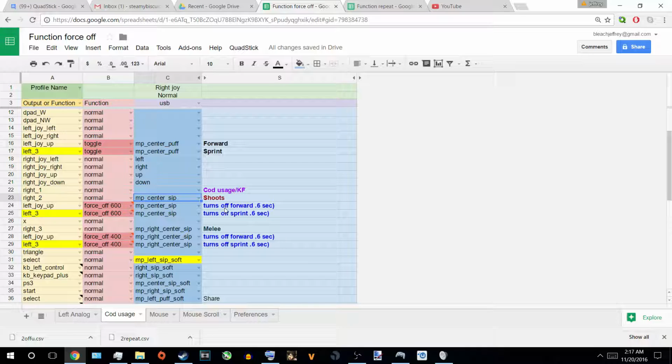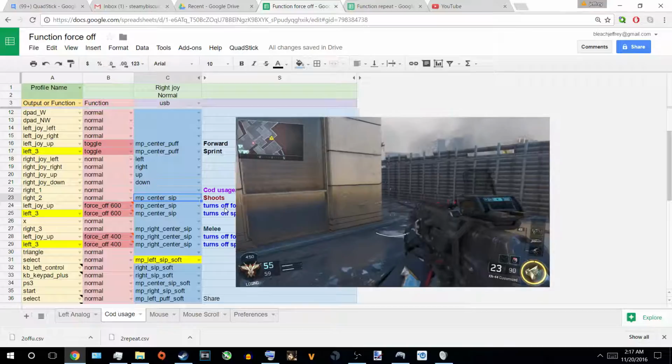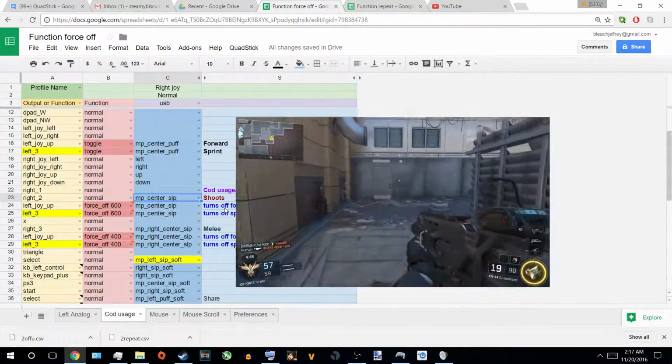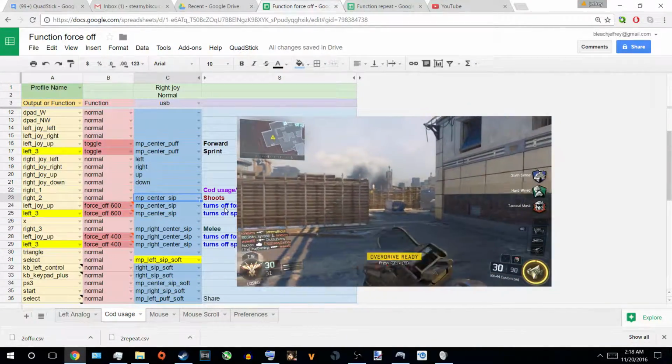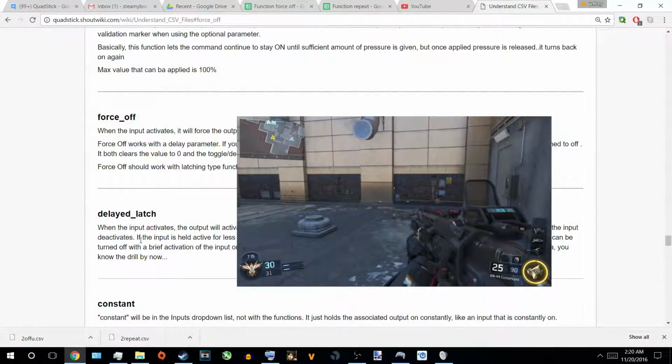And this is what it looks like. This is without stopping. And this is if I were to shoot more than 600 milliseconds. Alright, look, this is what force off does.